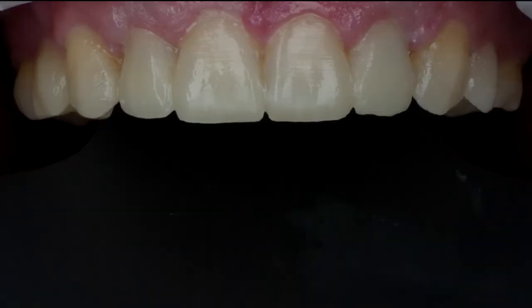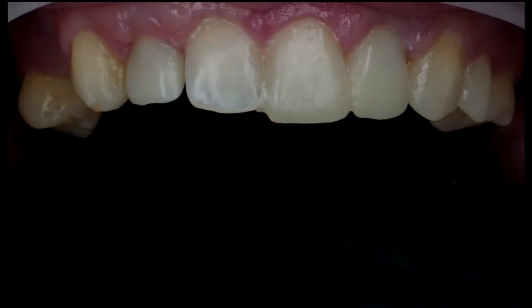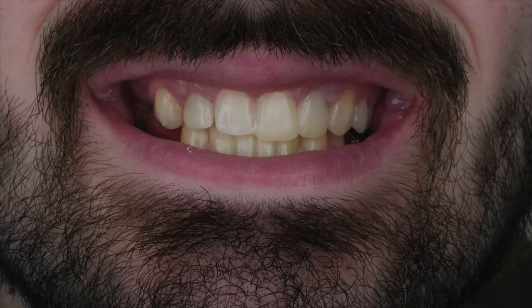Now, you could take a handpiece to this and add some surface texture and anatomy if you choose. You could also edit it. So if you needed to edit, you could rescan that as an intraoral scan, and you could use that as a record as well. So now, when I break this off, I like to break it off in sections so the patient could see just the profound difference of exactly what we were doing with the before and after, where one side is done and one side's not done. And you could see just the profound difference for this patient.